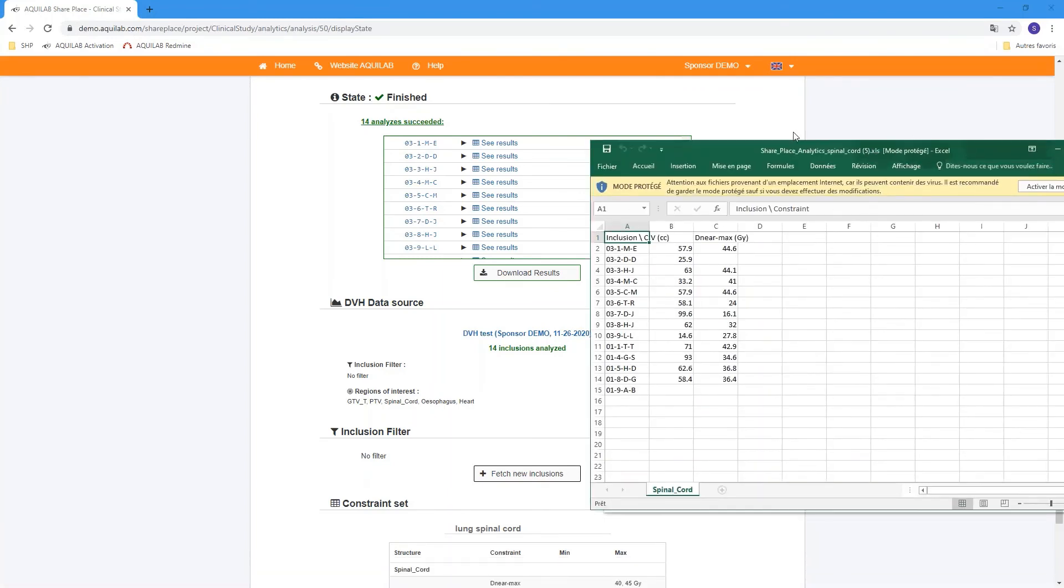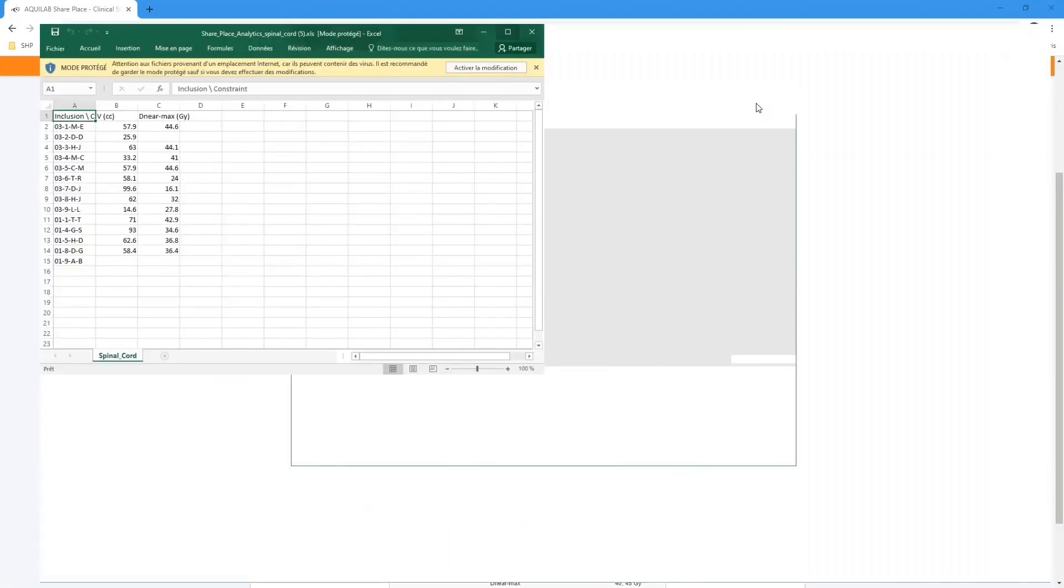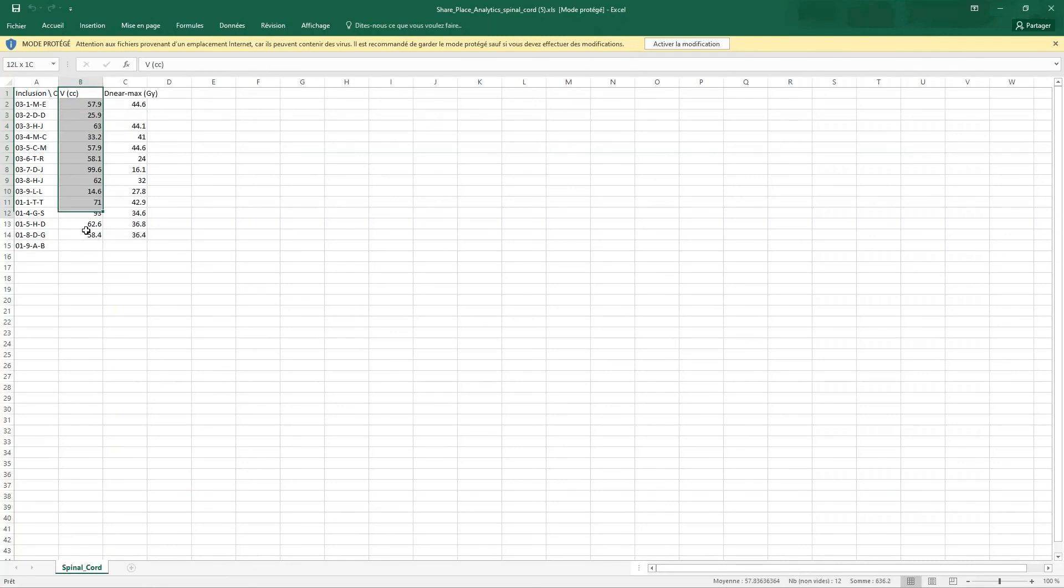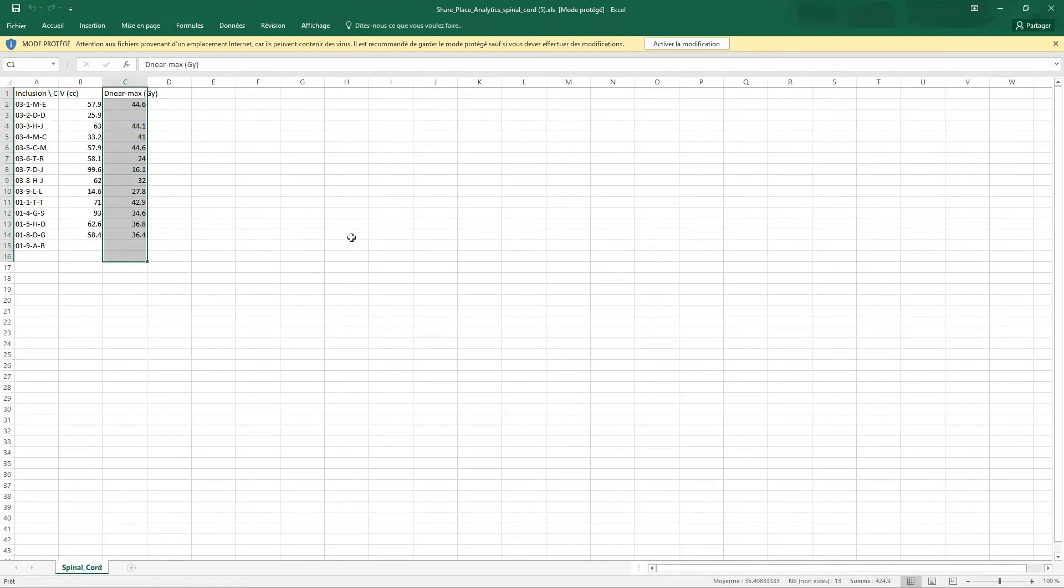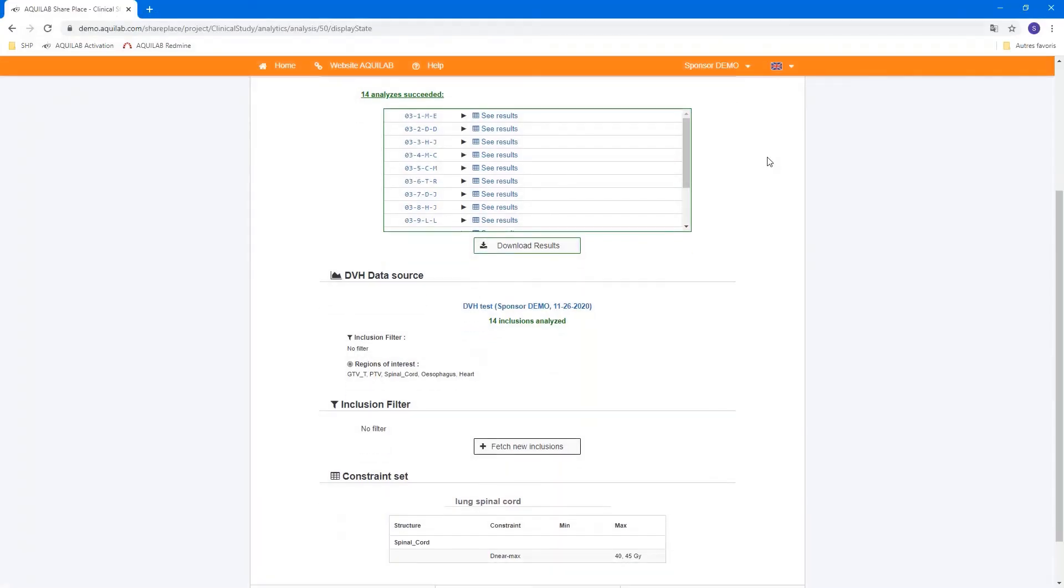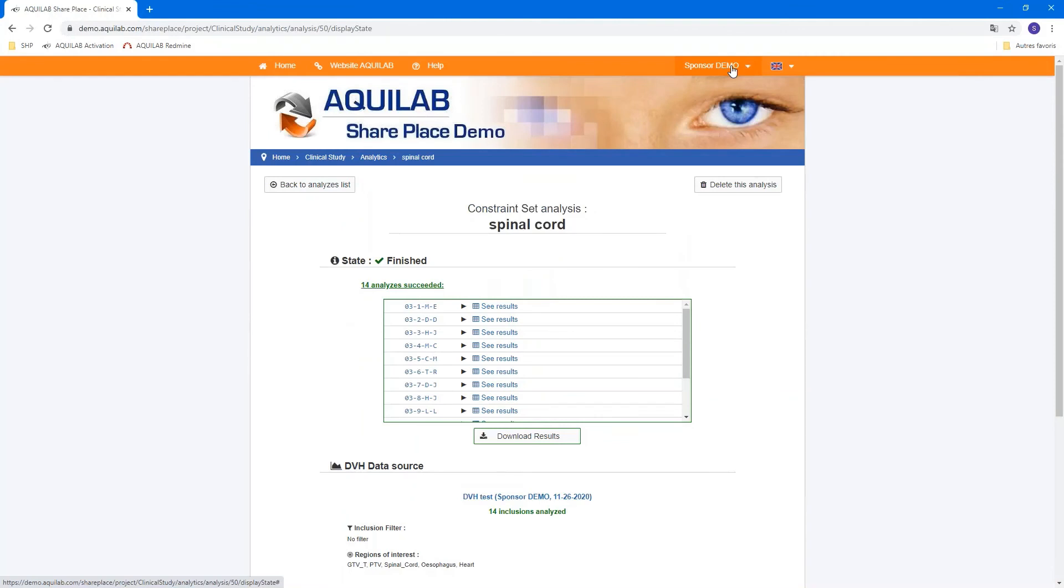You can now download the results for all the patients. The inclusion, the volume for the spinal cord, for example, and the Dmax calculated by the tool. And that's all for this brief demonstration of our solution Analytics for your clinical trial.